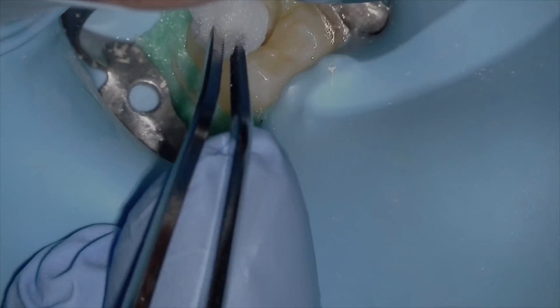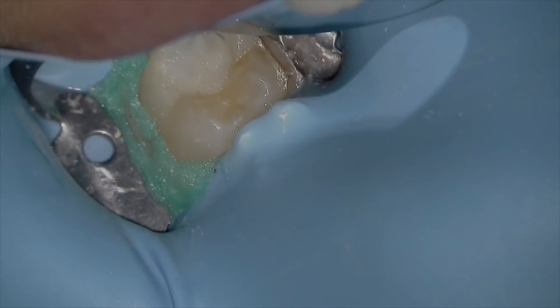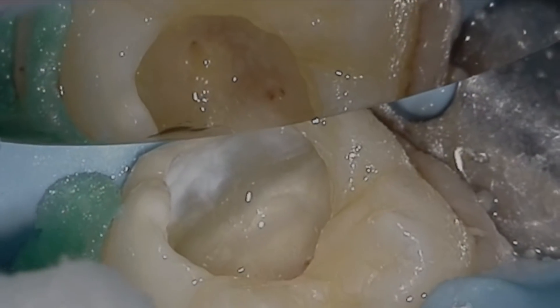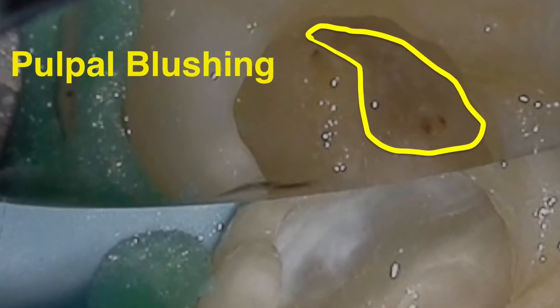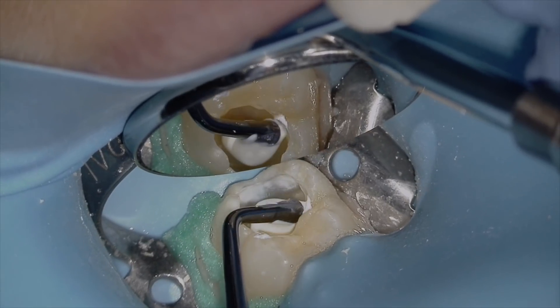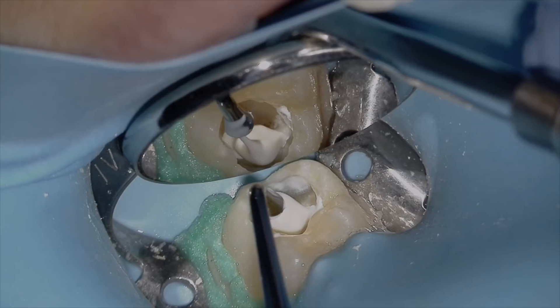According to the literature, the best results come from disinfecting the area with sodium hypochlorite, which also helps to control hemostasis. In this case, there wasn't a significant hemorrhage, so that doesn't play a factor. You can see here that we have two pulp exposures and also blushing of the pulp, indicating that we're super close to the pulp chamber. I elected to place root repair material from Brasseler all over the pulpal floor just to promote more dentin bridging from the rest of the pulp.